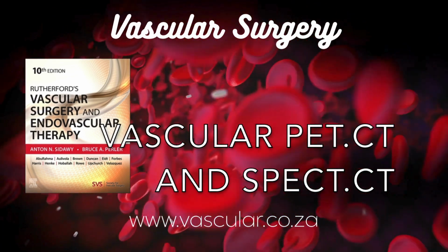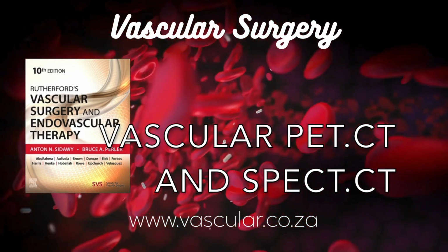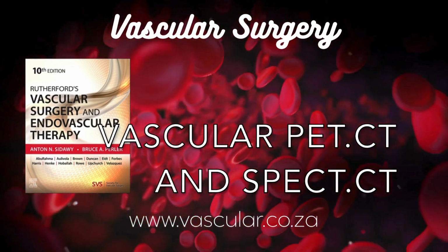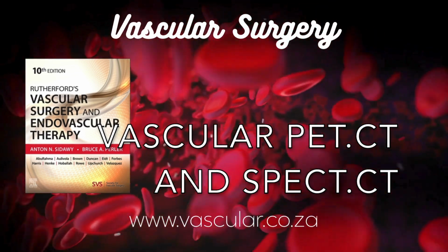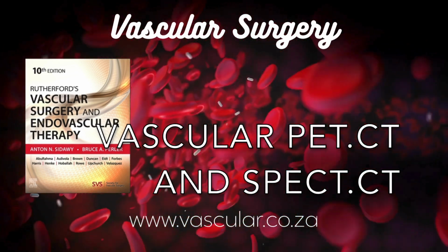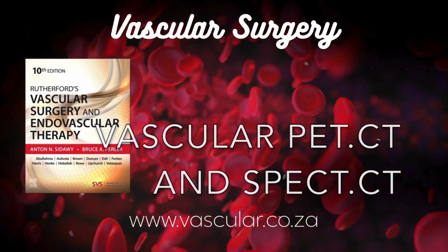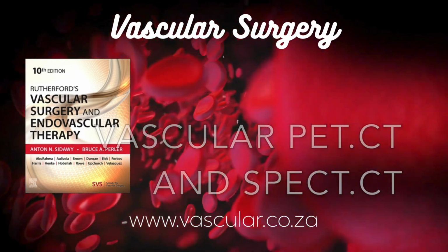level. Exactly, like traditional imaging shows us the pipes, right, the structure. But PET and SPECT CT, they let us see the activity inside those pipes. Things like inflammation, early warning signs. And that's the key, isn't it? Seeing those physiological changes, often before the structure itself looks dramatically different. It's non-invasive, too. Which could mean catching problems earlier, intervening sooner, maybe better outcomes down the line. That's certainly the hope and the driving force behind a lot of this research.